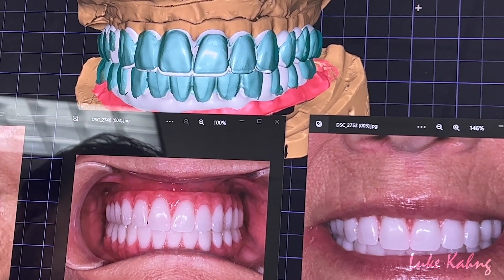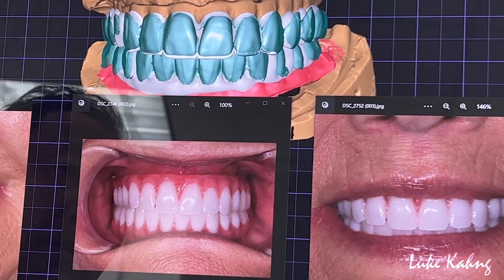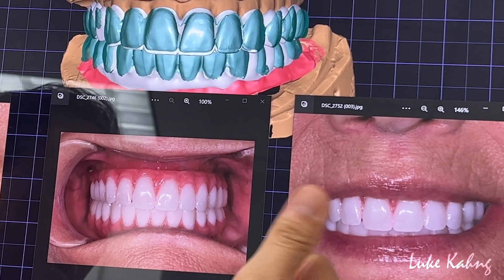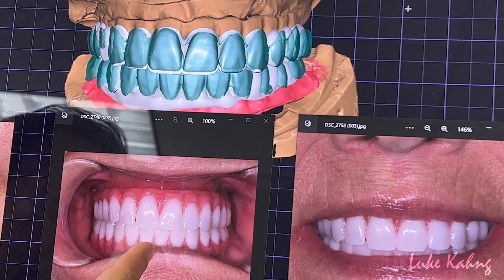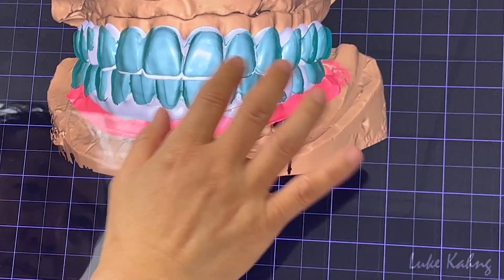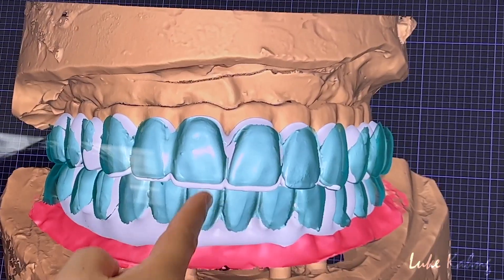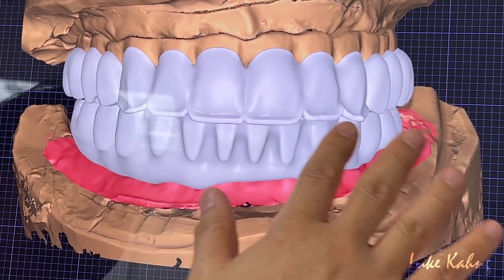And then we designed from the after-scan — the lower as well. This is the patient's mouth, which is great. The midline was off on the lower, so we changed the midline trying to get the correct one. Here is the starting point, trying to get the midline. Follow this. And then we cut it back.